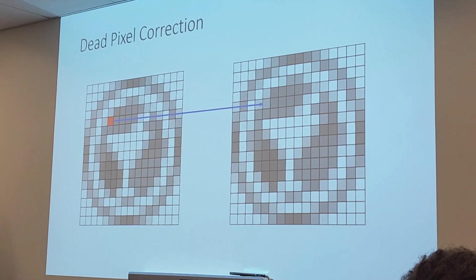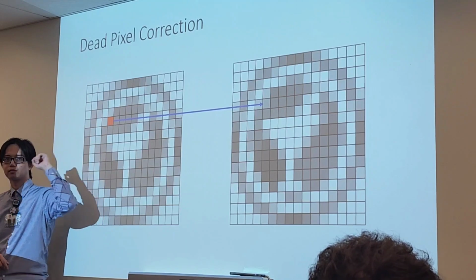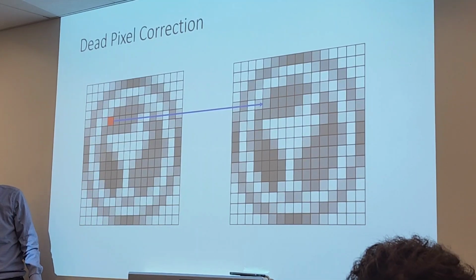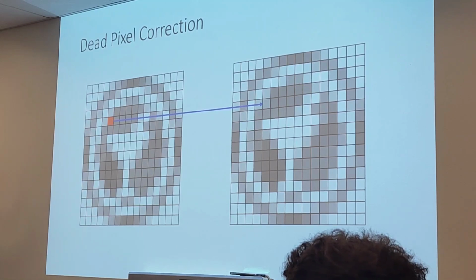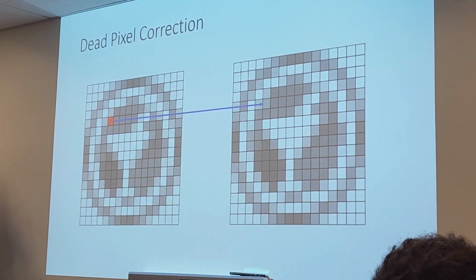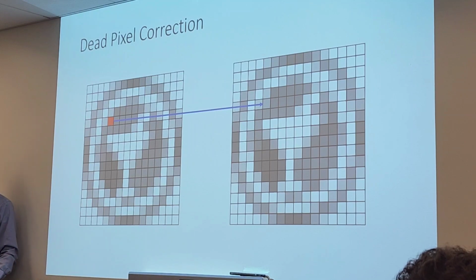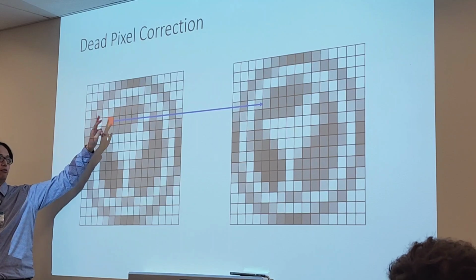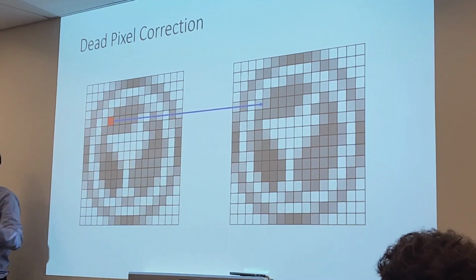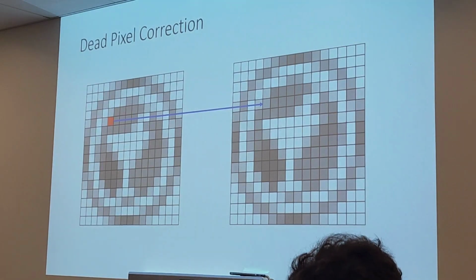How do you know that's the dead pixel? There's 3 corners in that same section that are all a lot darker than that one. Normally you wouldn't be able to tell just looking at the image, and that's exactly the point. You're not supposed to know where the dead pixel is by looking at an image. It's supposed to correct it to the point where it looks normal. So rather than having dead pixels inside your image, we just hid it by giving it the average color of the surrounding pixels.